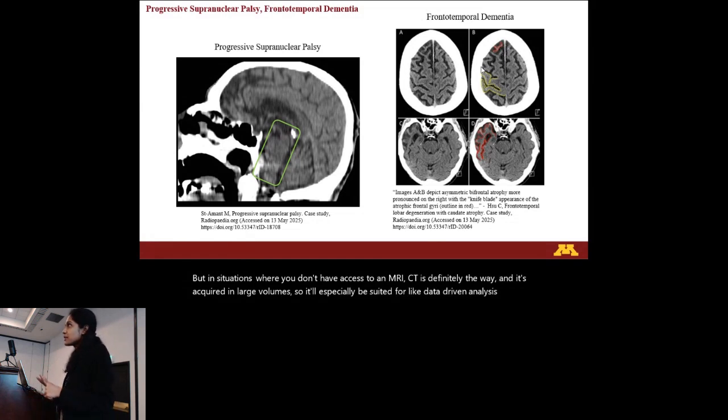Going back to your question about advances in the field that help us look at CT more, I feel like yes, in terms of technological optimization of how CT is acquired, we're getting crisper, more highly resolved images at lower radiation doses.